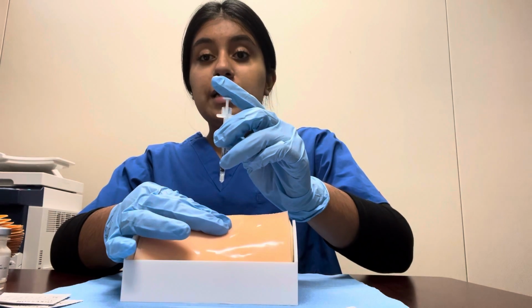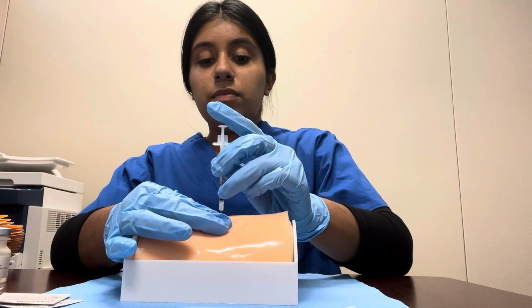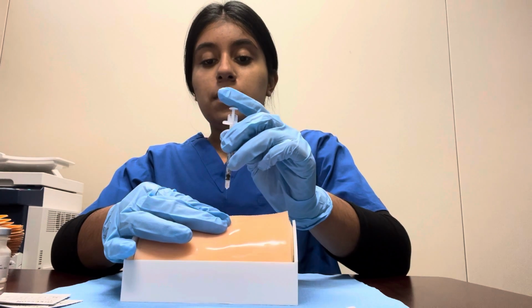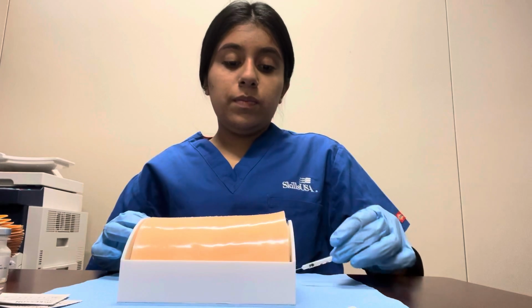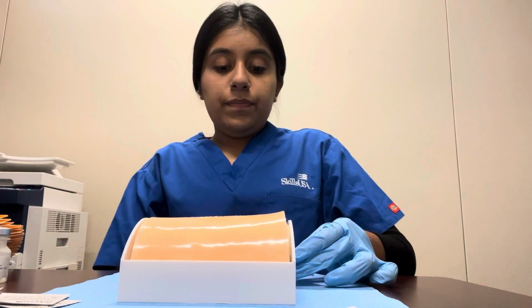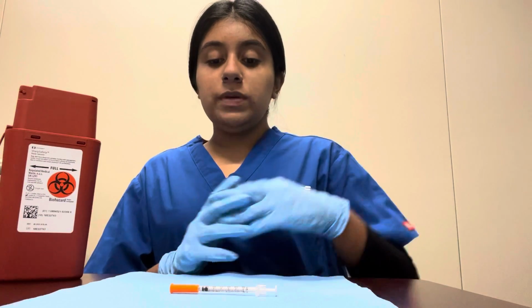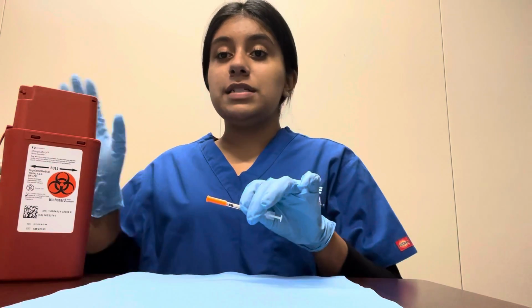I will insert it at a 90-degree angle and make sure to recap correctly. Now that we have properly given our patient their insulin, I will be disposing the insulin needle in a container like this.